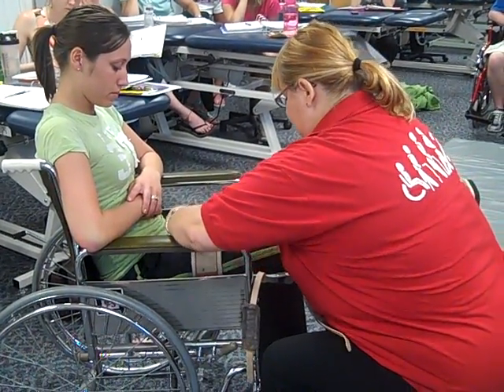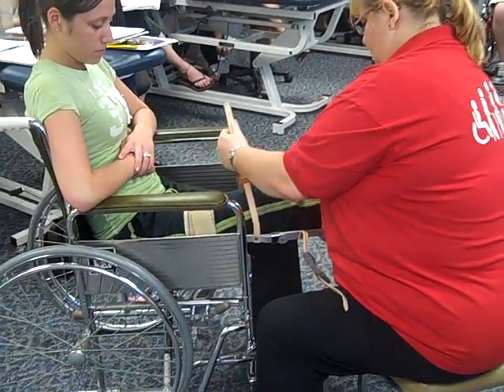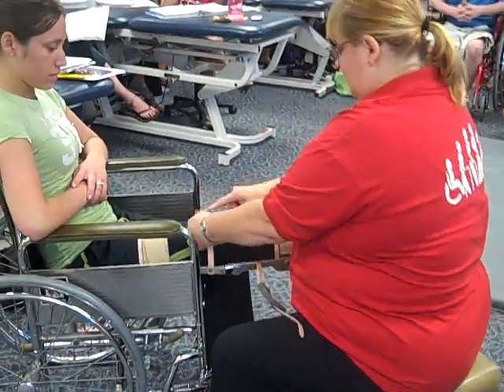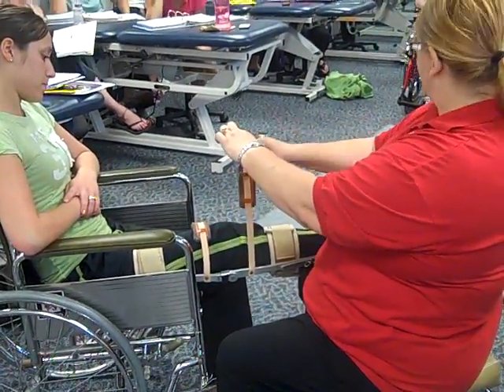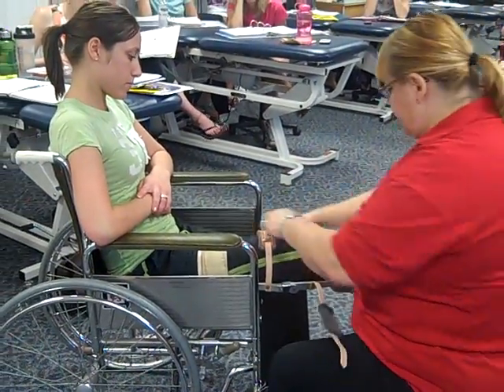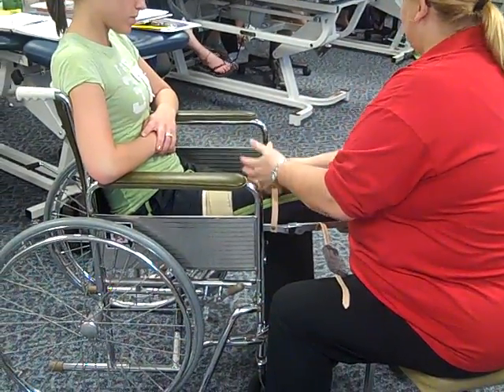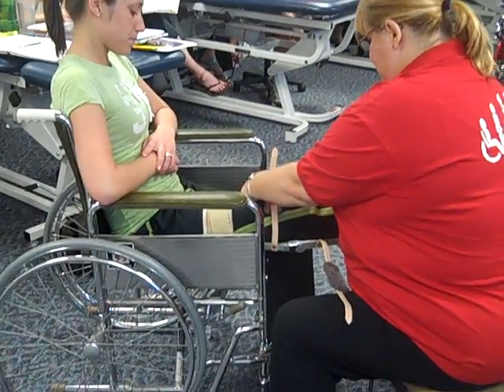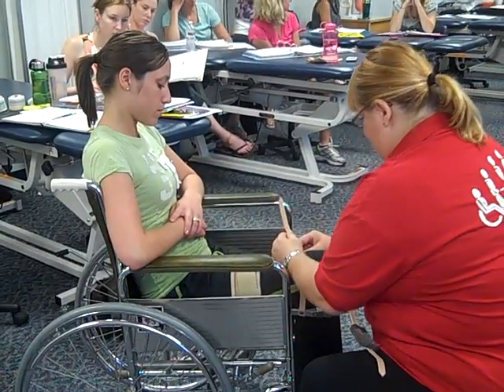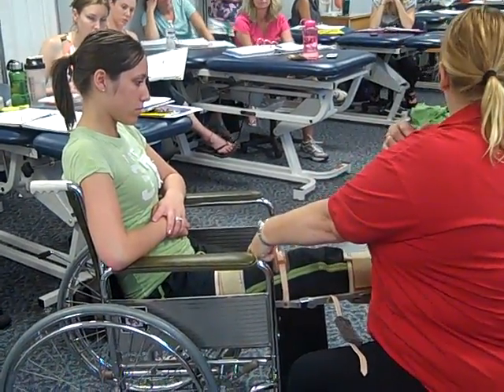I'm going to take this and tighten it. These pads on here slide, so you can put them where they're most going to go over the boniest areas. Comfort isn't so much an issue with this patient — they don't have sensation — but you still can damage things, so you have to make sure you're not so tight that you're going to hurt something. I can still get my finger in there, so that should be good.